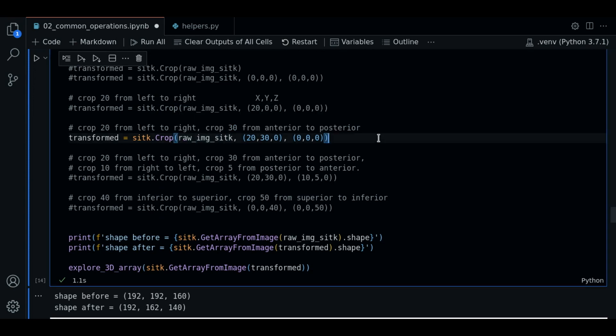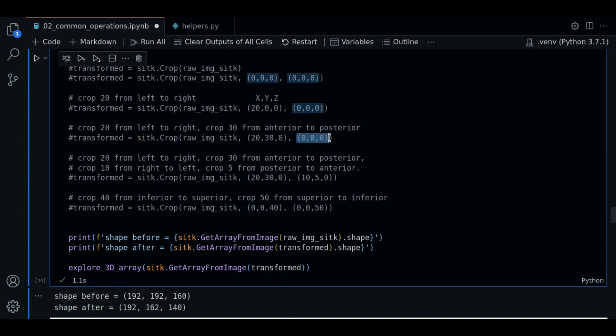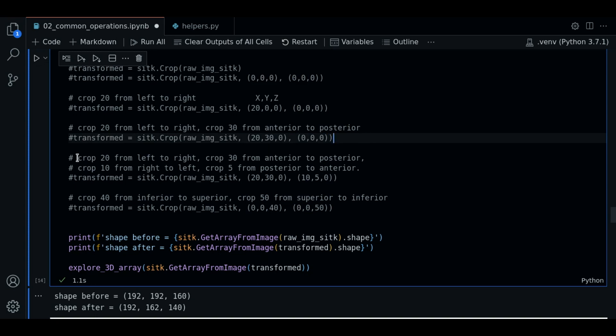And we can keep cropping. Just a reminder the first tuple is the lower boundary vector. The second tuple is the upper boundary vector.